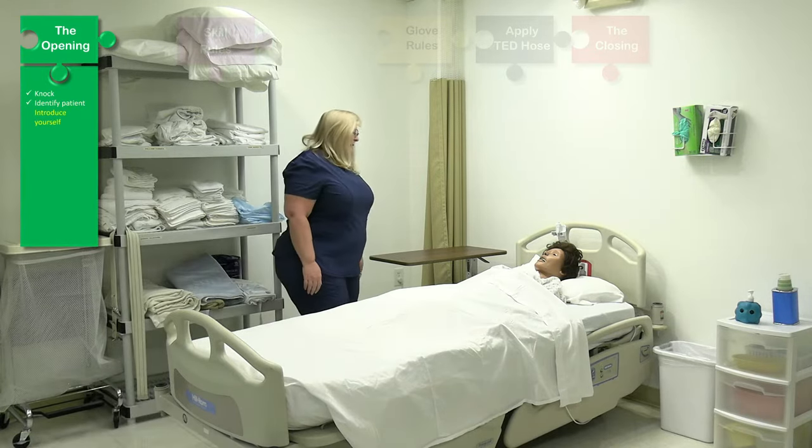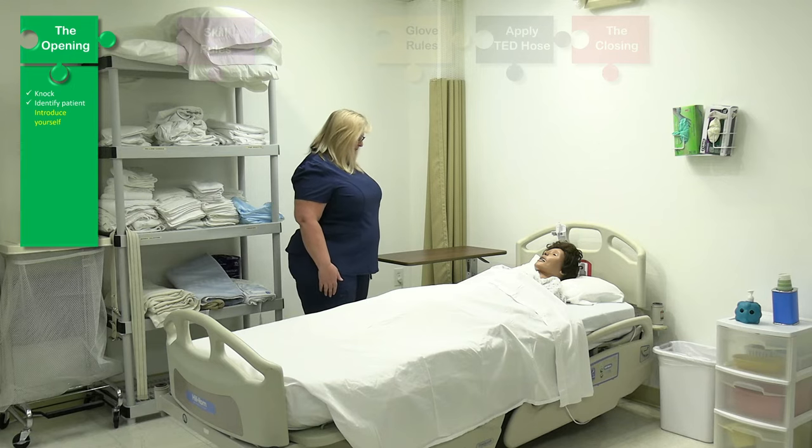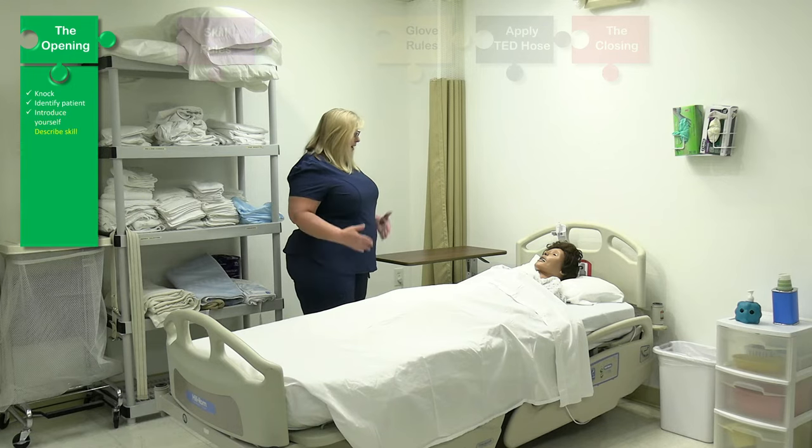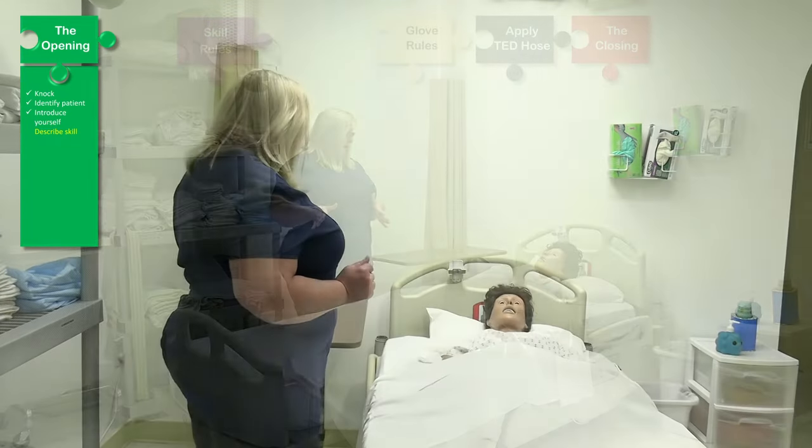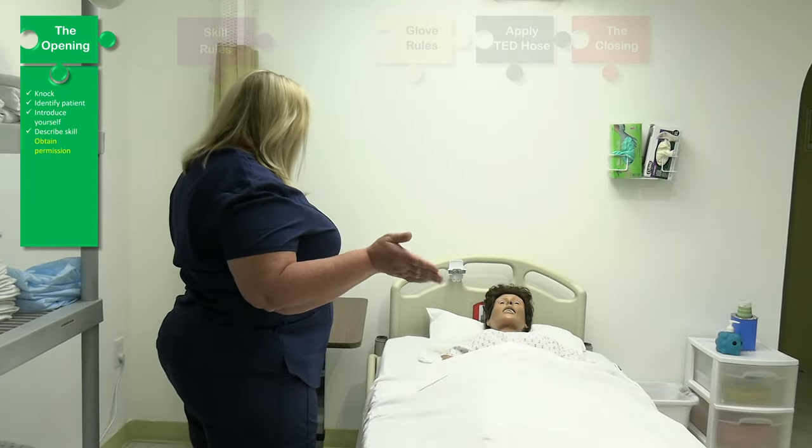Hello, Mrs. Jones. My name is Patty. I'm your CNA today. How are you? I've been assigned to apply TED hose or anti-embolic stockings to your left leg. Is that okay?